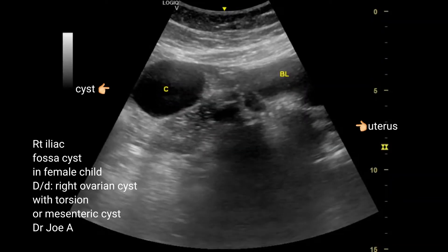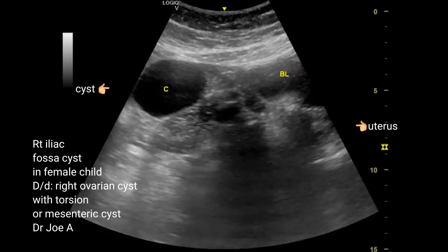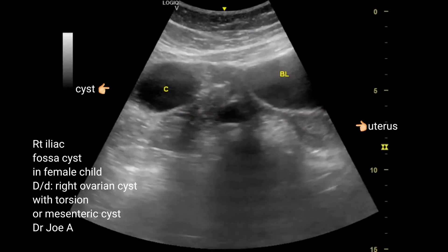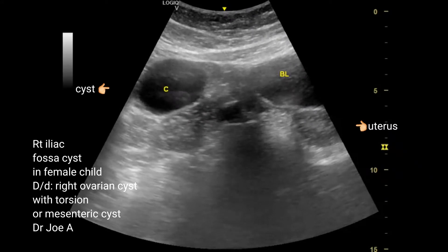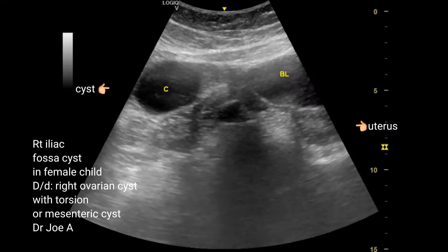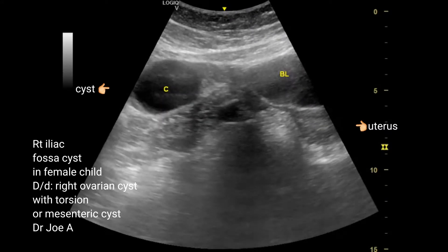Cystic lesion in the right iliac fossa in a 12-year-old female child with history of pain and tenderness in this region.